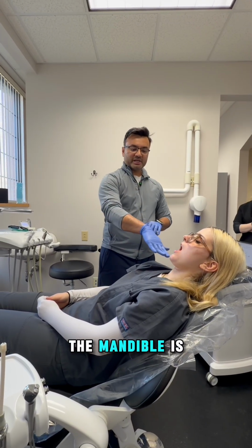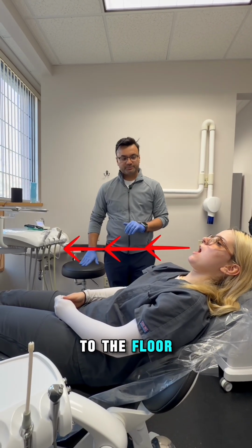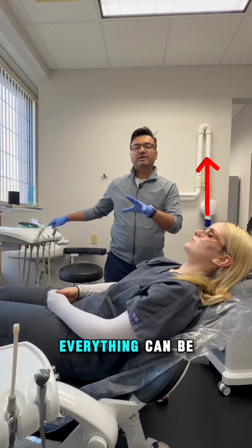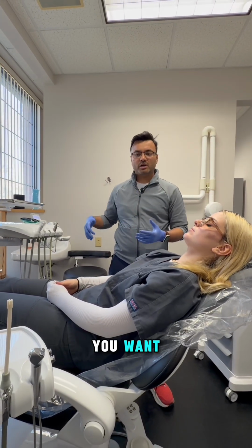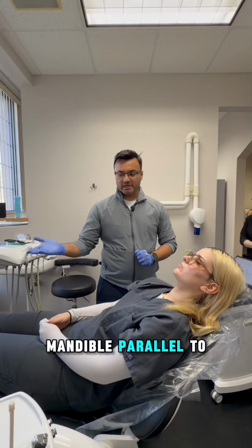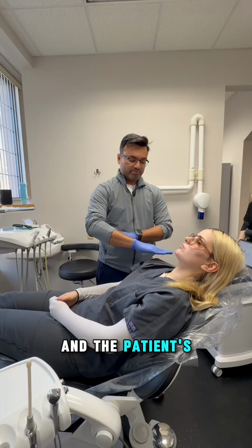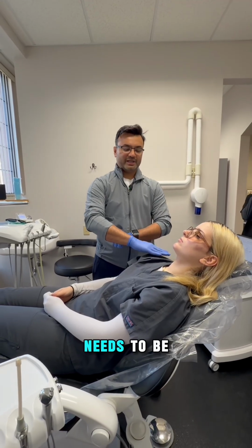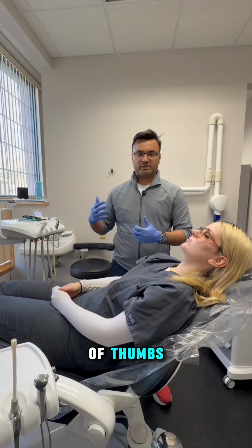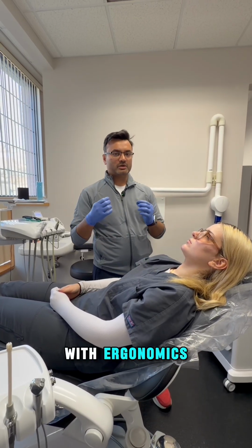Now I can feel that the mandible is much more parallel to the floor, and now the height matters. And I will always say, again, everything can be customized the way you want, but I'm just talking about the general rule of thumbs. Mandible parallel to the floor, and the patient's shoulder needs to be at my elbow level. These are what I call rule of thumbs, easier to work with ergonomics.